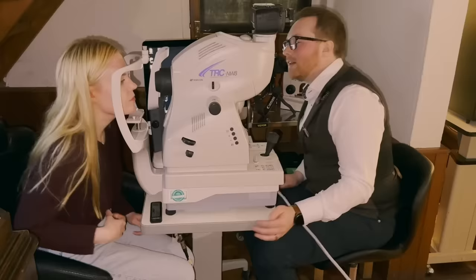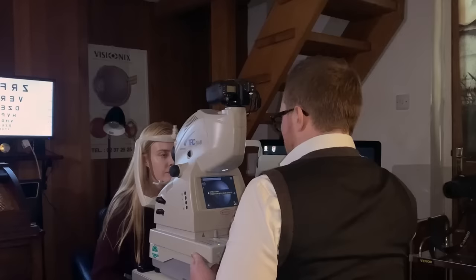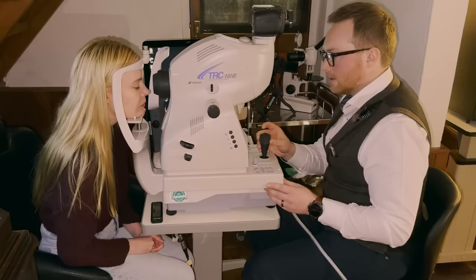Right against the bottom. Is that comfortable there for you? Perfect. Right, so looking straight ahead. Now, you should see a little yellowy-green light straight in front of you. If I could get you to keep looking straight at that for me, there's going to be a flash of light in a moment when it takes the photograph. Very good. Right, flash that one. There we go. Let's look, that's nice and clear.